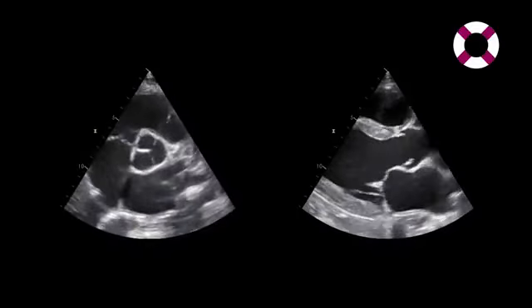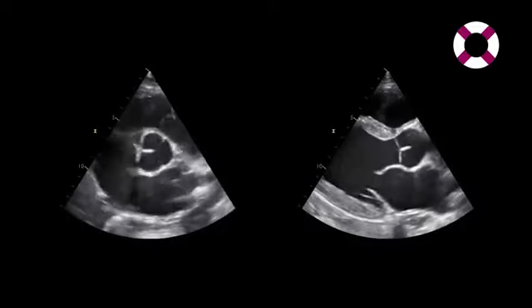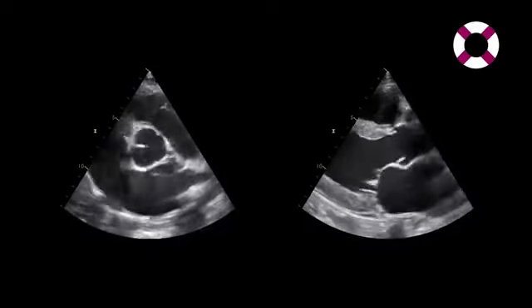There's only one prerequisite. You first have to be able to see the valve and be able to image the valve. Here are just two examples that show you how clearly we can visualize the heart valves with echocardiography.